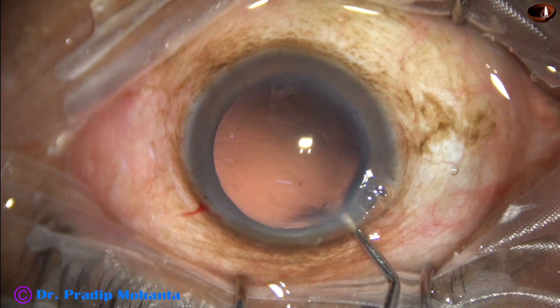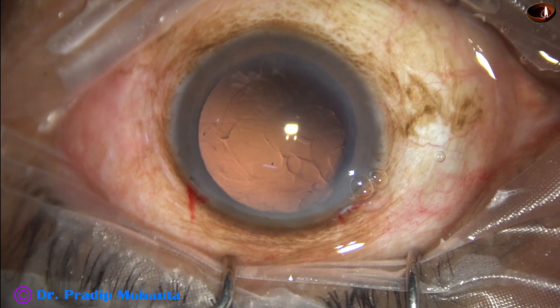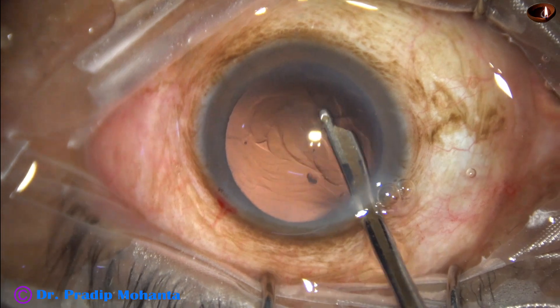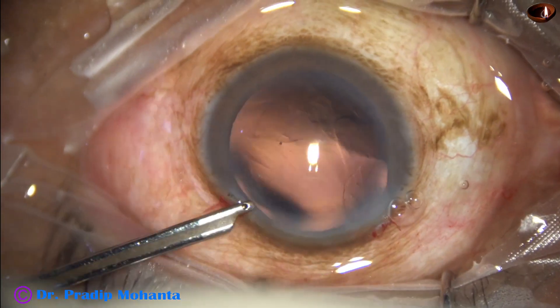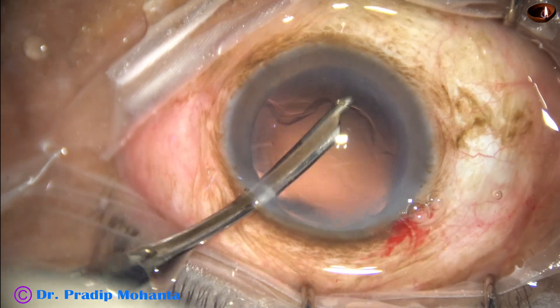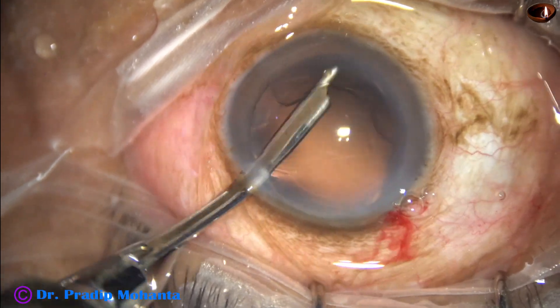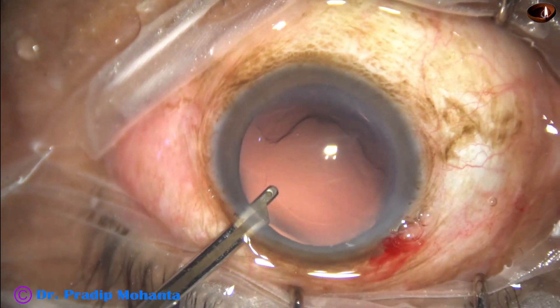We inject some visco. There is some cortex at six o'clock and some lens fibers sticking to the posterior capsule here and there. We remove the cortex from six o'clock and remove the lens fibers going through the side port. This is a 23-gauge Simcoe cannula; it goes through a 1.7-millimeter wound.